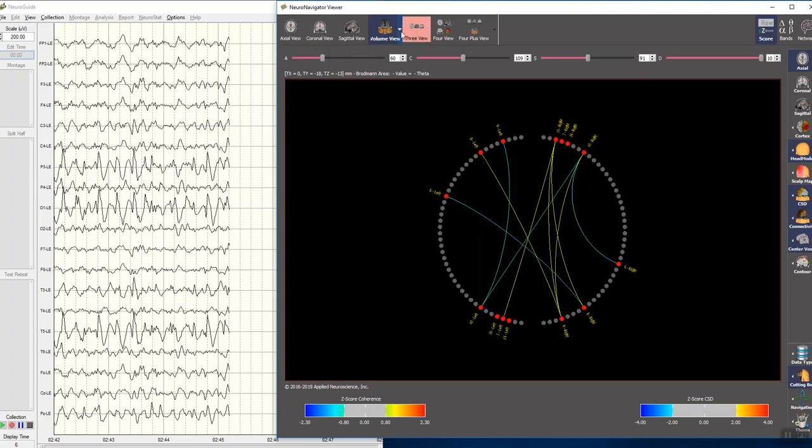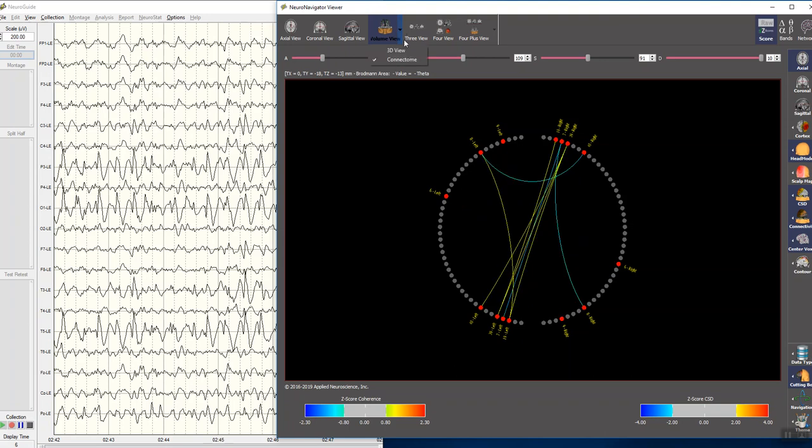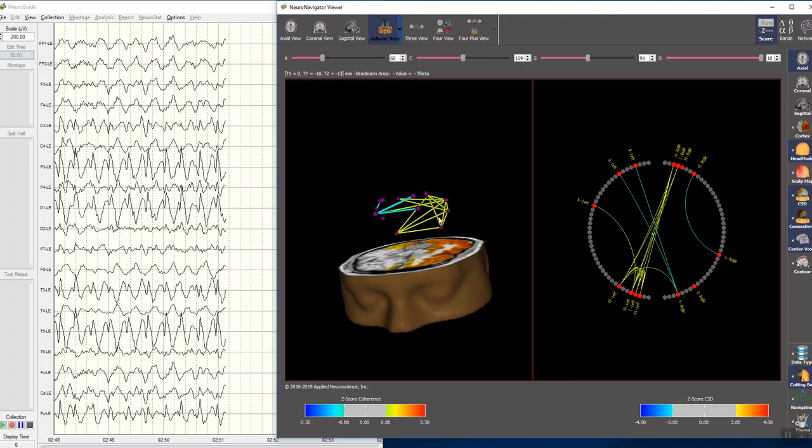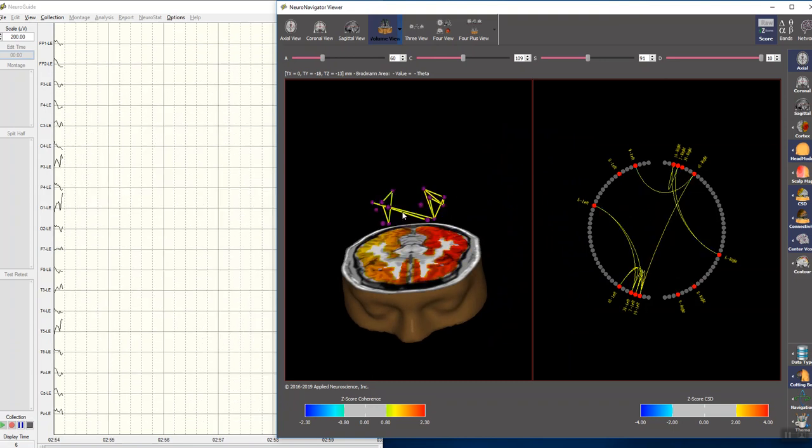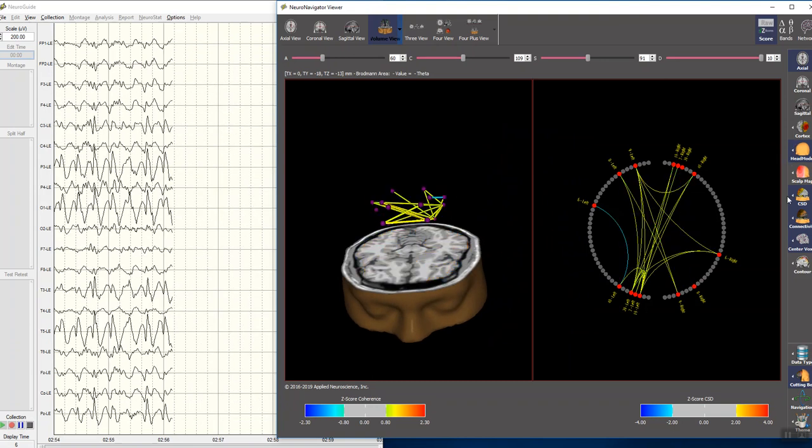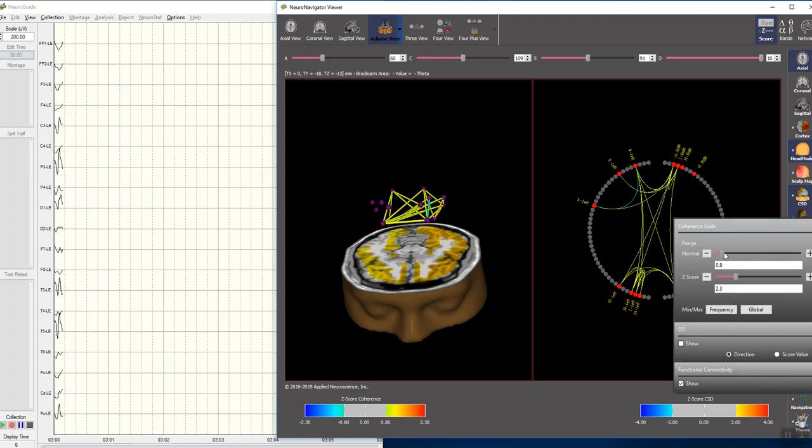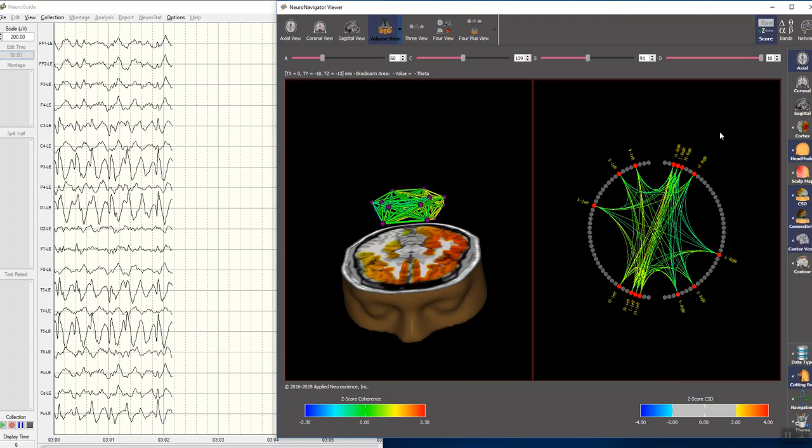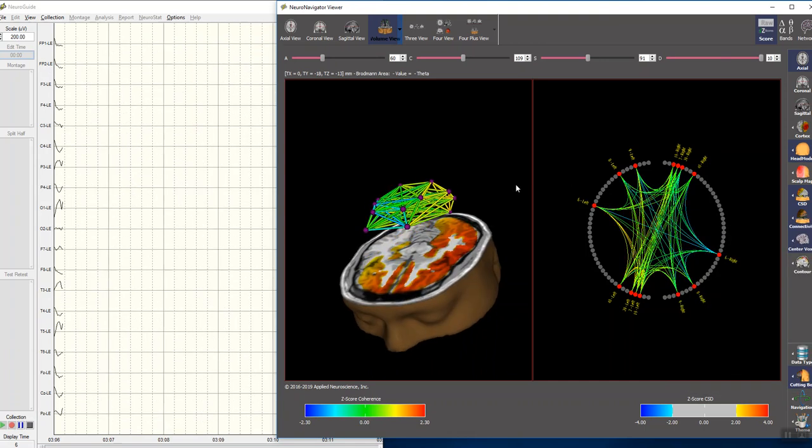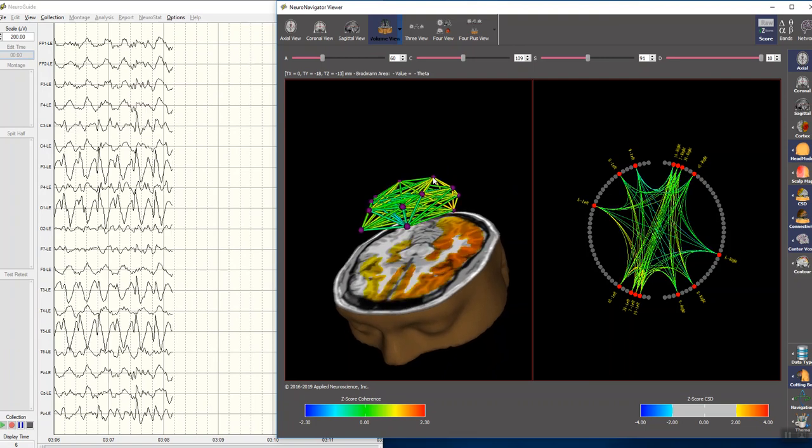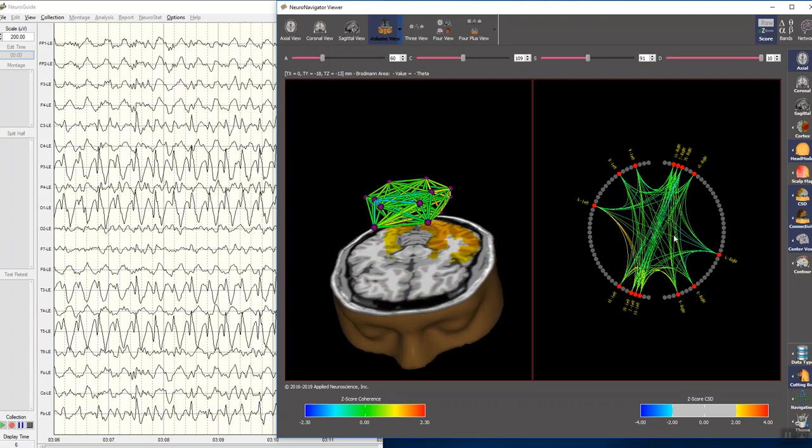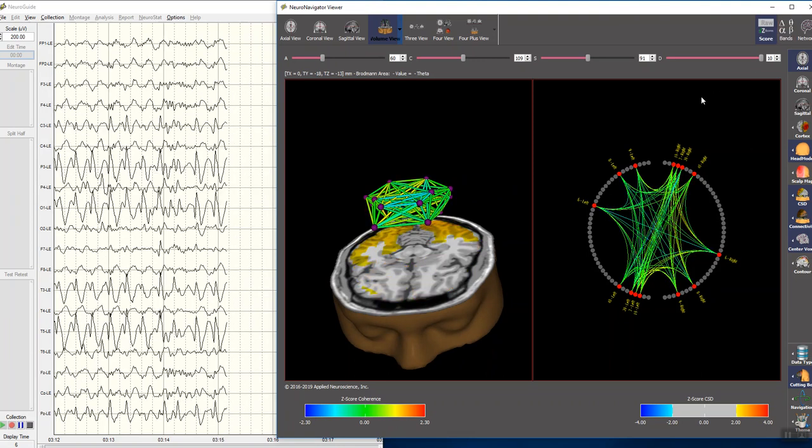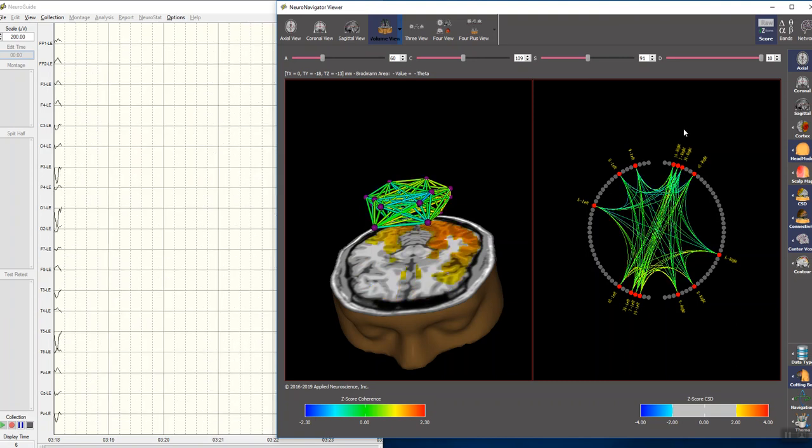And you can do that also for the connectivity tubes that are connecting Brodmann areas in three dimensions. And as I change these thresholds, you'll be able to see that the same ones are lit up. The difference now is that this is a three-dimensional volume and this is a two-dimensional image on the right here, but they're the same things. And again, we have a lot of different controls to allow us to view these networks in real time.